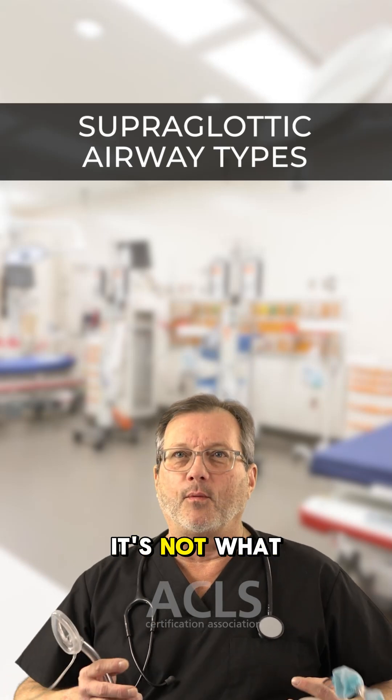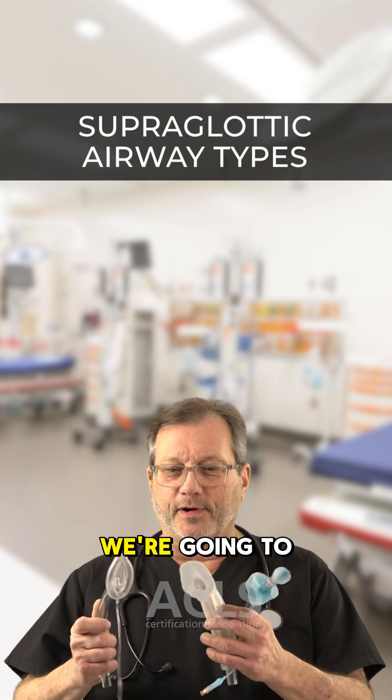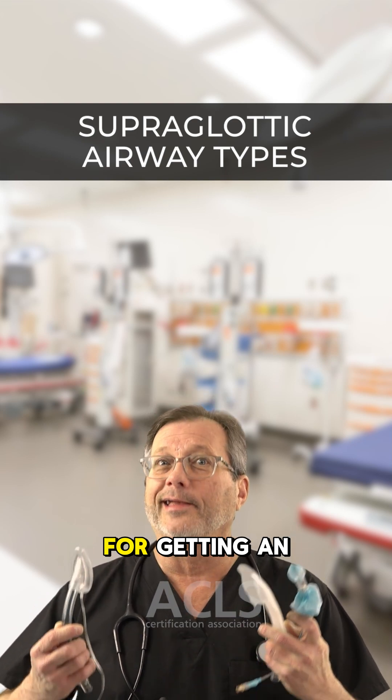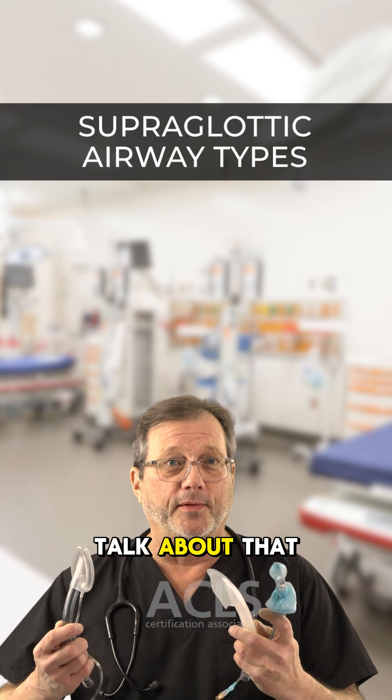Hi everyone. You know I'm always saying it's not what a thing is for, it's what can it do. And today we're going to discuss these three supraglottic airways that are all for getting an airway. How they do it is completely different. We're going to talk about that right now.